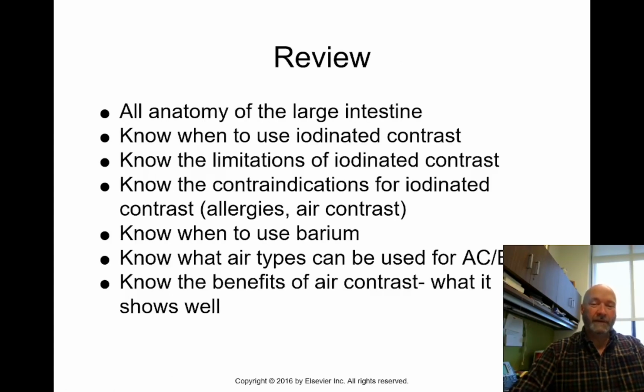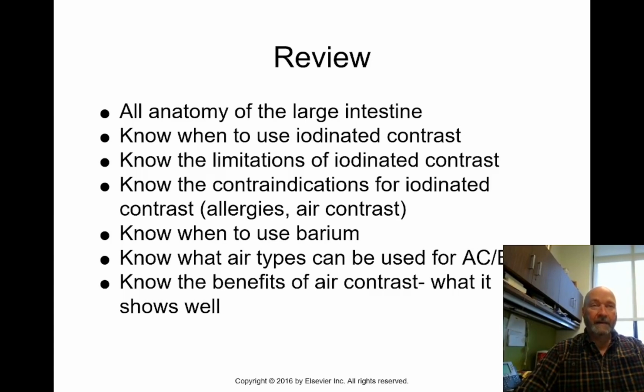So you got to know all the anatomy from drawings, from descriptions, know when to use iodinated contrast, know the limitations of the iodinated contrast, and that is you can't do double contrast. Know the contraindications for iodinated contrast, and that unlike your injectable contrasts, the iodine may play a larger part. So know your patient's allergies.